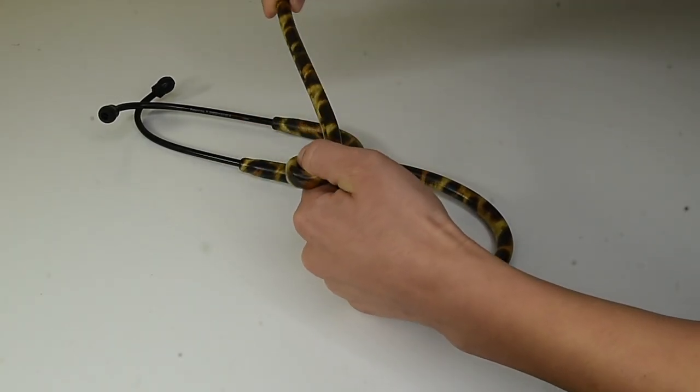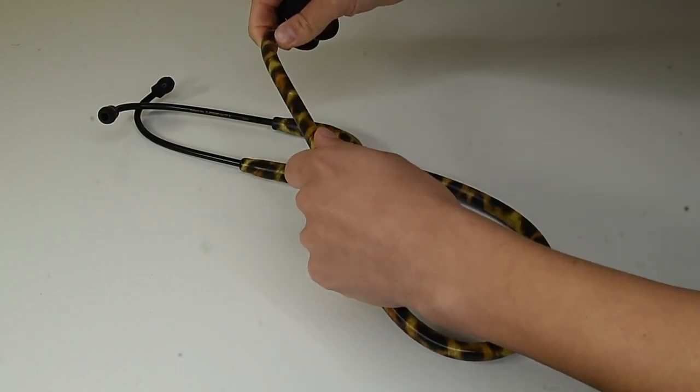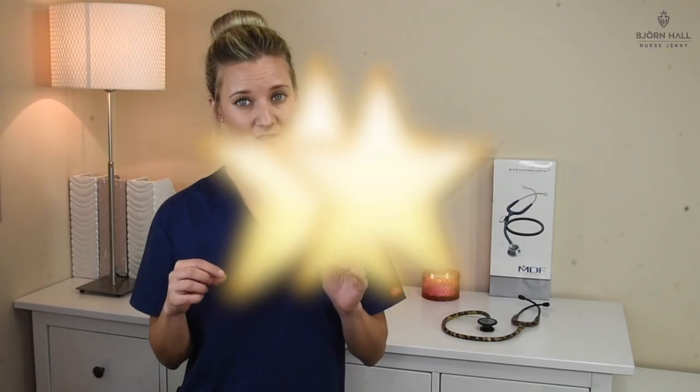Tubing feel. The tubing is nice and flexible. However, it is a little bit sticky and I also noticed some bubbles, which I think is due to the print on the stethoscope. I've given it a two out of five.